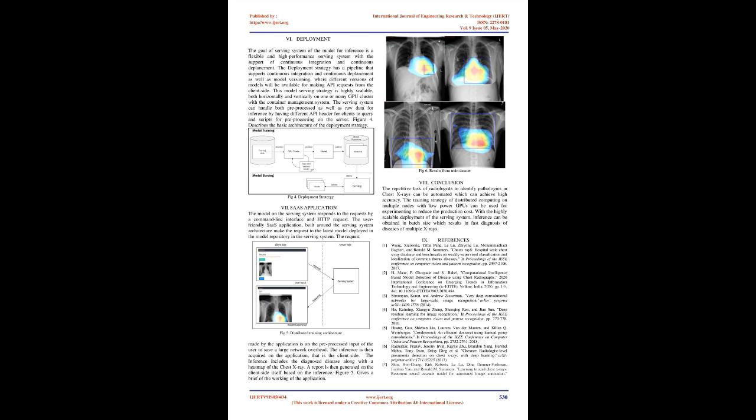The multi-node strategy uses an all-reduce communication method to keep variables in sync with each other. Figure 1 describes the basic architecture of the multi-node training strategy. The chief node is responsible for additional tasks like saving logs and checkpoints. This training strategy enables the building of flexible GPU clusters for faster and parallel training.